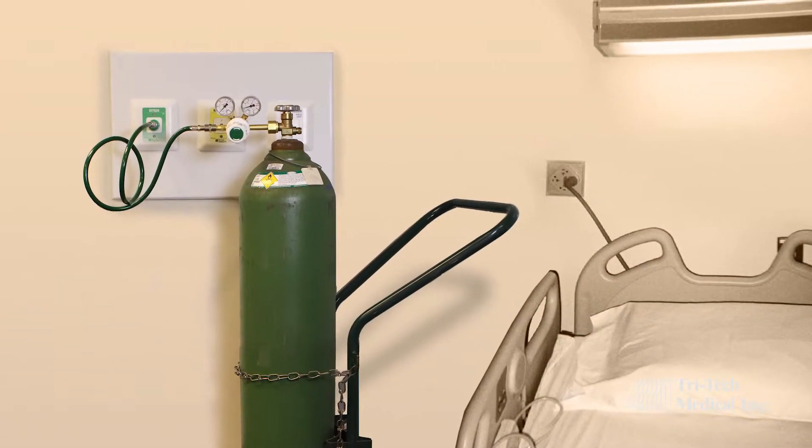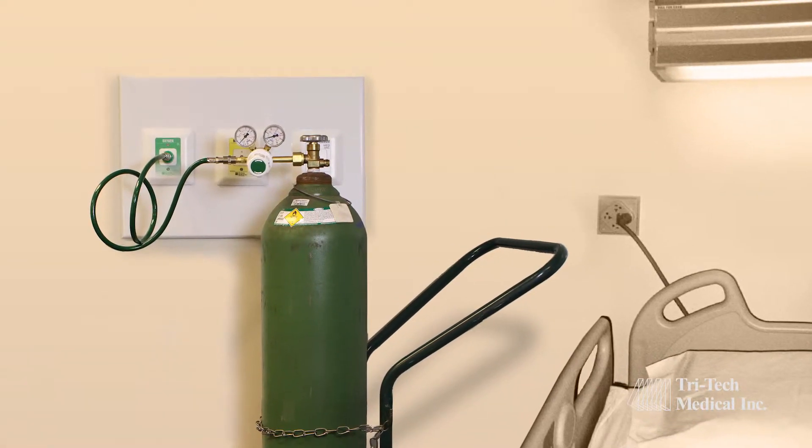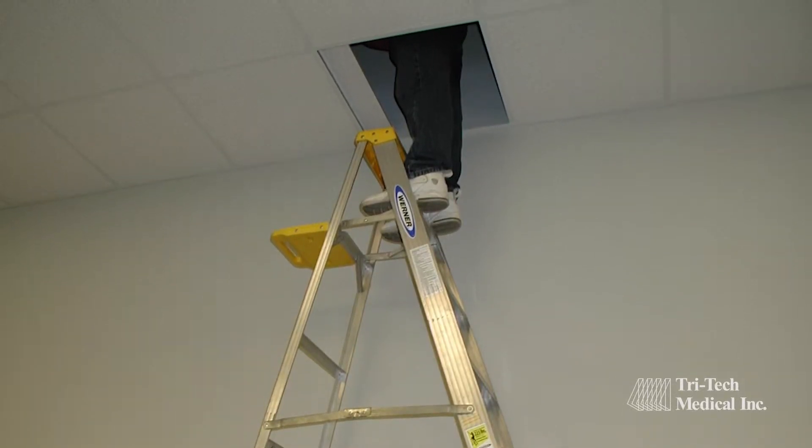Does your facility backfeed medical gases through wall outlets located in patient rooms? Are your area alarm sensors located above the ceiling?